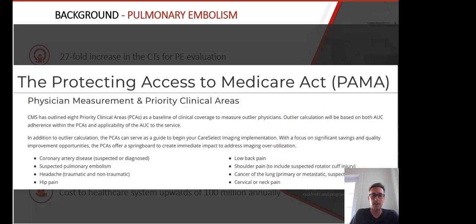And in fact, this has been a focus of legislation recently to identify pulmonary embolism, and of course the CT examination example that I showed you is exactly the study that's used to identify pulmonary embolism. There's been a lot of work to try to reduce the resources necessary to make this diagnosis.